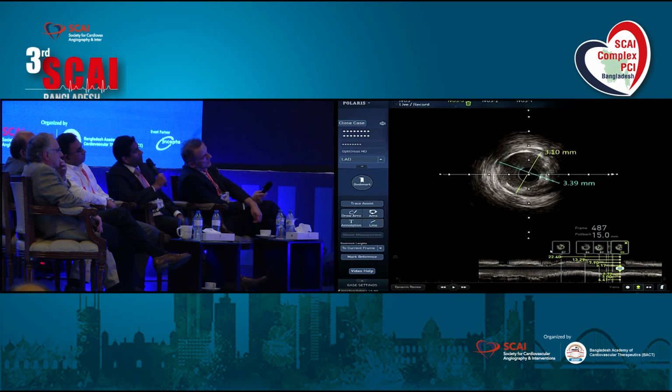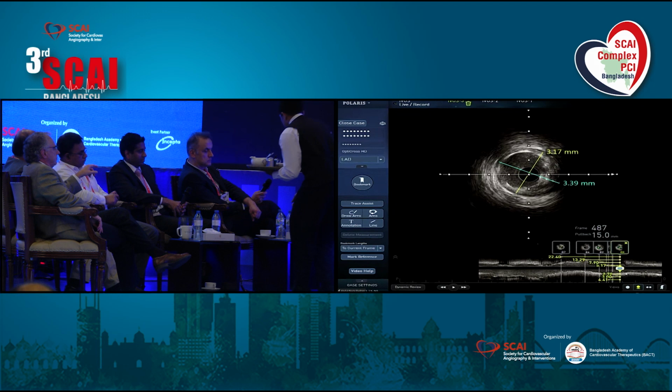Ramesh, did you give nitrates? Because I agree, it was 2.5, but now it's gone bigger. So probably even some nitrates or maybe flow has made it bigger. If we gave some nitro, we were worried the blood pressure suddenly dropped, but that is a faulty measurement, I think. But at the moment, blood pressure is all right.